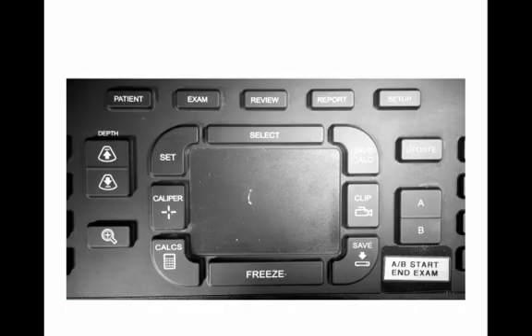Once the curvilinear probe is selected, please set its initial depth to maximum. You can do that by pressing the depth button. You want to increase the initial depth to maximum, about 20 centimeters. We want to see the whole structure on the screen initially, and then we can decrease the depth to achieve greater magnification.